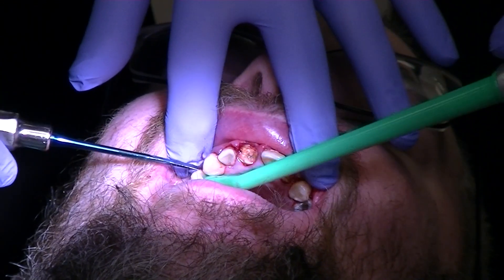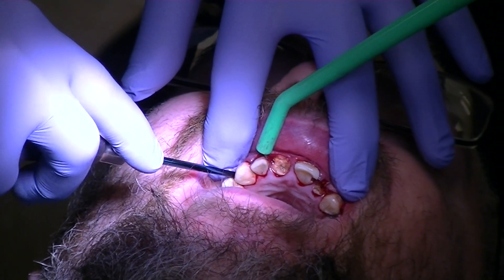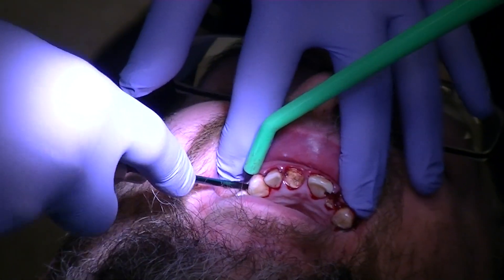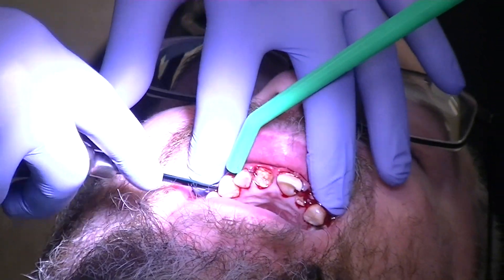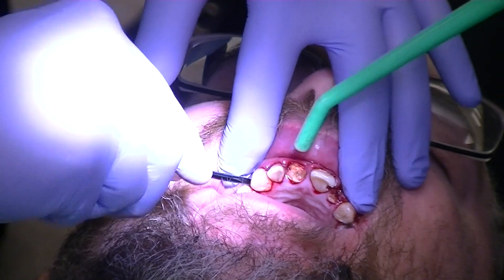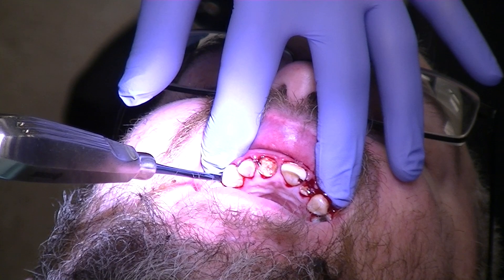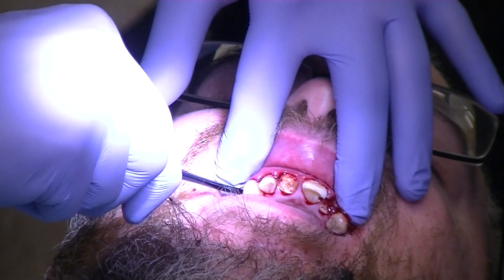Now we're going to go with the wedge. Remember, you don't want to go in sideways — you want to go in at a 10 or 15 degree angle. I'm going in and rotating a little bit. Then I'm going to do the same in this direction. These are pretty decayed — it's sort of mush in there — but we're just going through the movement.